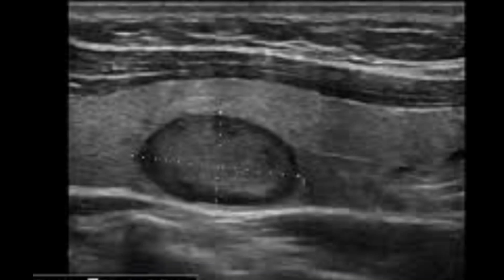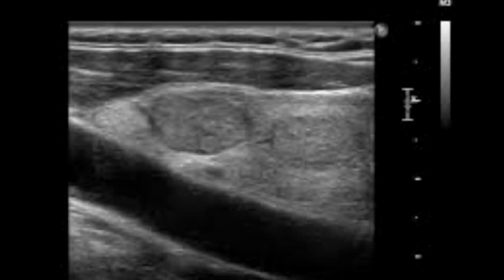In the thyroid lobe you can see there is a hypoechoic nodule with a well defined surrounding halo. That halo is hypoechoic. This type of nodule would be typically benign, and it would be classified as a U2 benign lesion. So this is a clear example of U2. Compare echogenicity of the nodule with the thyroid gland. It appears to be slightly hypoechoic.